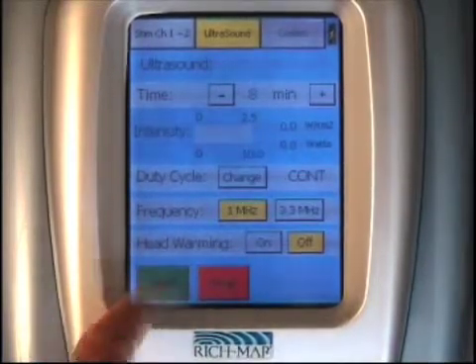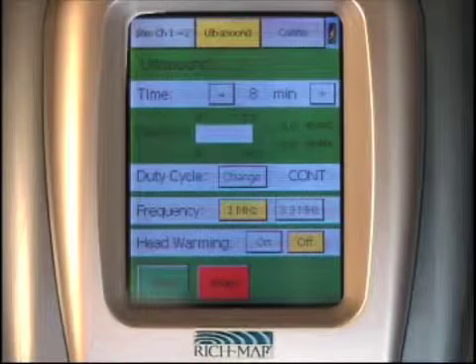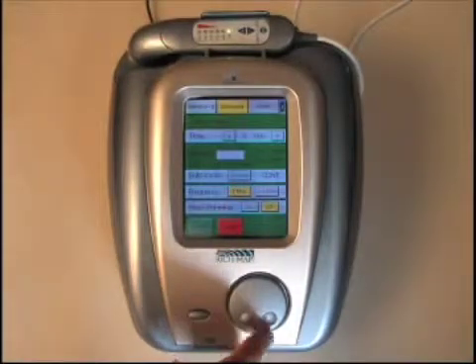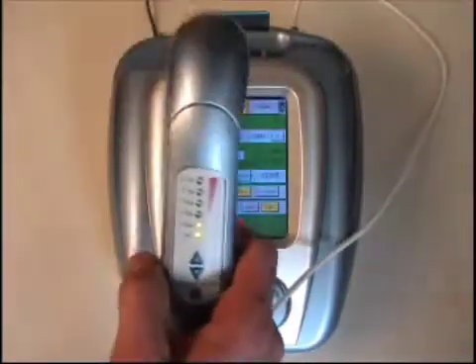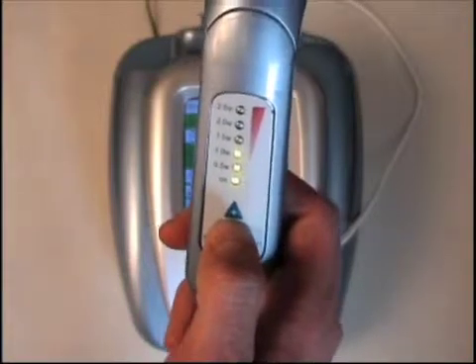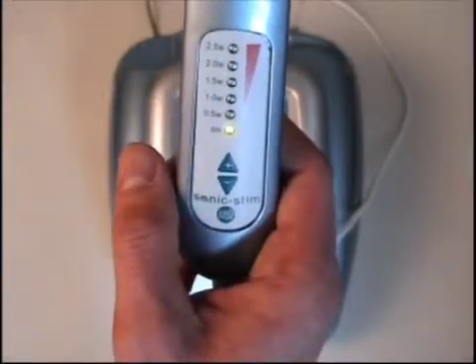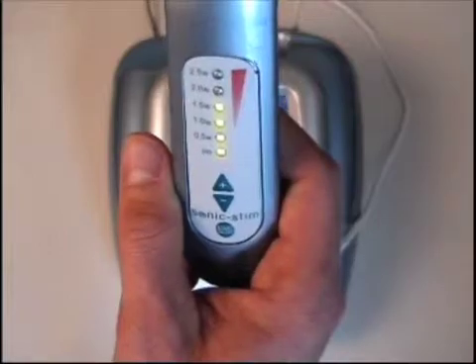Once the treatment is in progress, you select start and the background will go green indicating that the treatment is live. The Sonic-Stim has an exclusive feature that allows you to control the unit either on the on-board applicator controls or on the intensity dial at the bottom of the unit — either of which can control the ultrasound intensity. Once you've selected the intensity, you have the ability to go up or down via the on-board applicator. If you want to stop or pause the unit, you can do so at any time. By selecting that button, the light will begin to blink indicating that the treatment is paused. Once you press the button again, the treatment will resume at the time and intensity at which you left off.